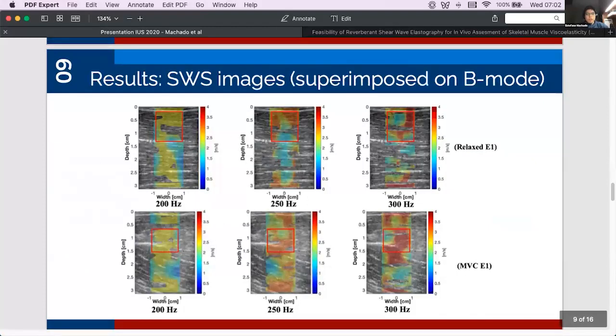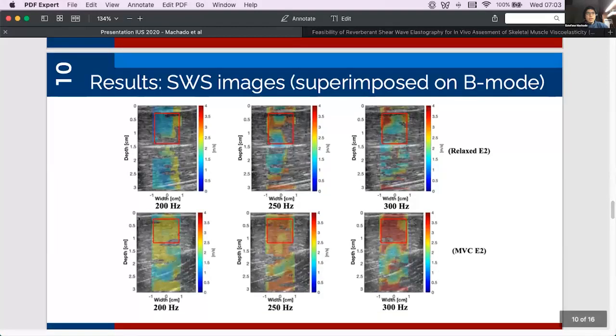So let's take a look at the results. These are the shear wave speed images superimposed on the corresponding B-mode images for the first relaxed and MVC experiments. As you can see there's a high surface area of color pixels in the selected regions of interest indicating that most of the estimated shear wave speed values in these regions present a high resemblance to the theoretical model and thus for us it indicates the presence of a reverberant field. These are the same results for the second experiments.